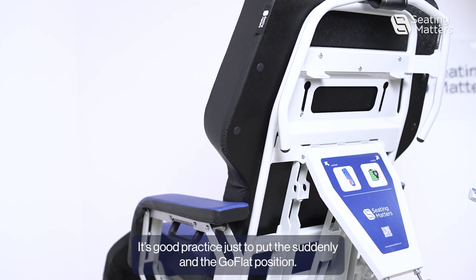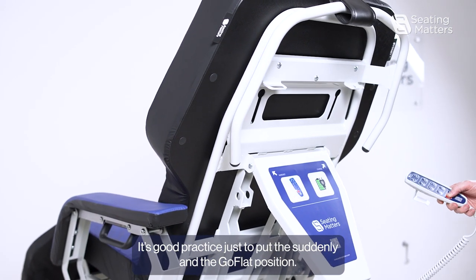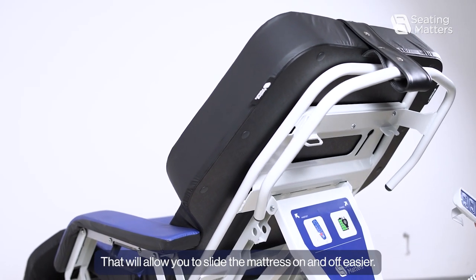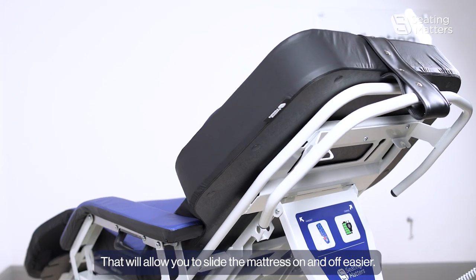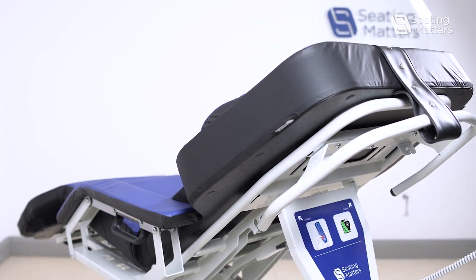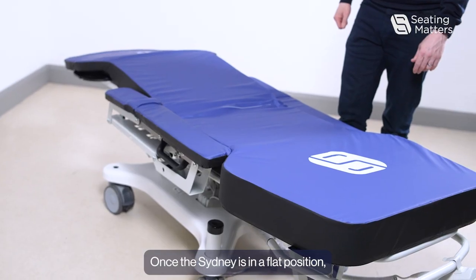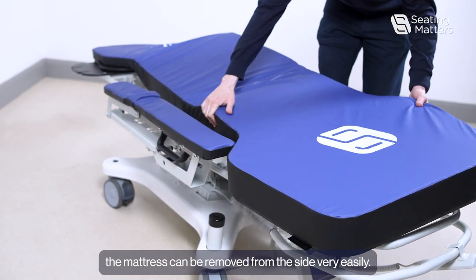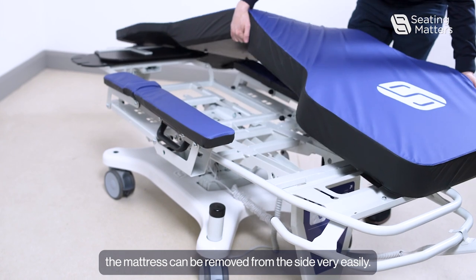it's good practice to put the Sydney in the go-flat position. That will allow you to slide the mattress on and off easier. Once the Sydney is in a flat position, the mattress can be removed from the side very easily.